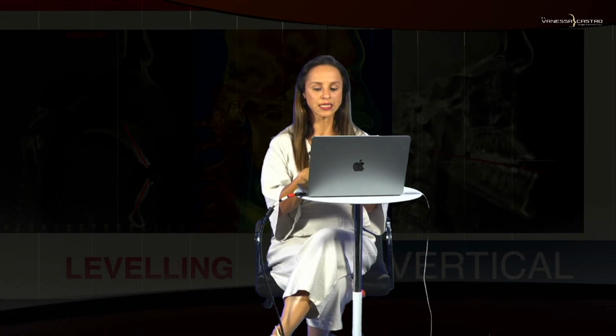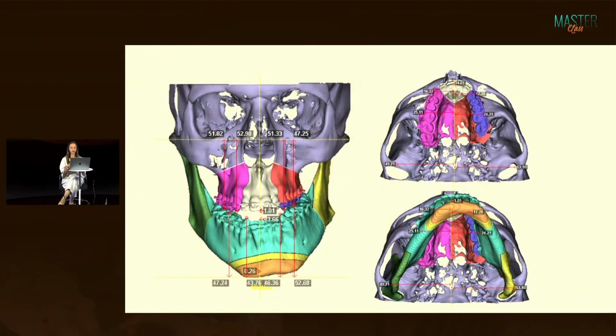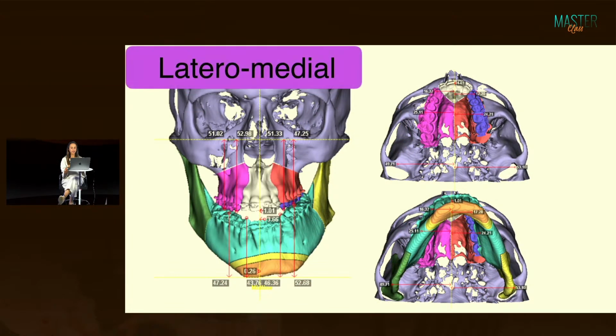So all the axes, I have to decompensate orthodontically. And here, look at the CT of this patient prepared for orthognathic surgery. I have the discrepancy in the teeth, and I can measure the difference from one side to the other side.